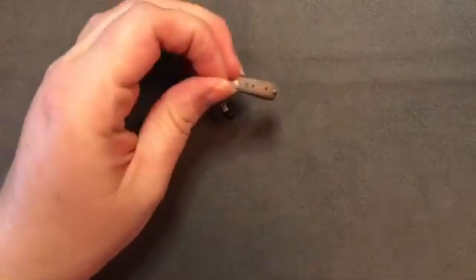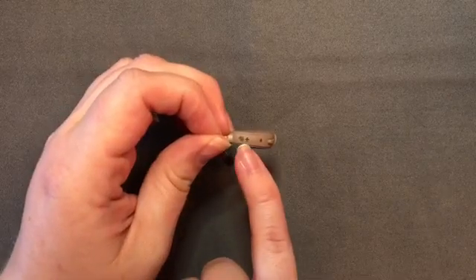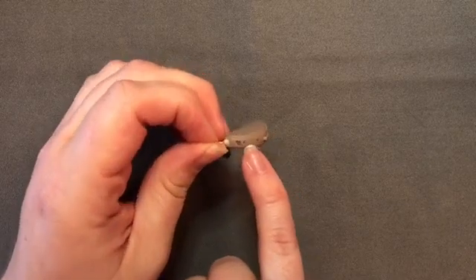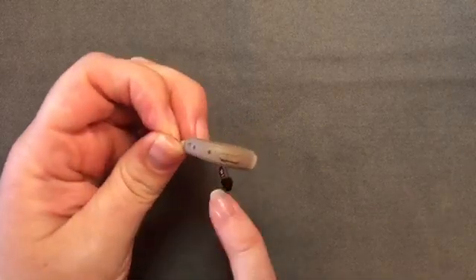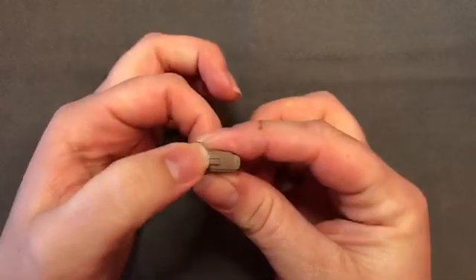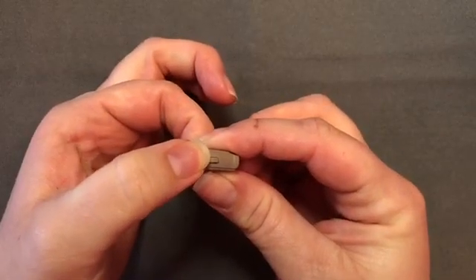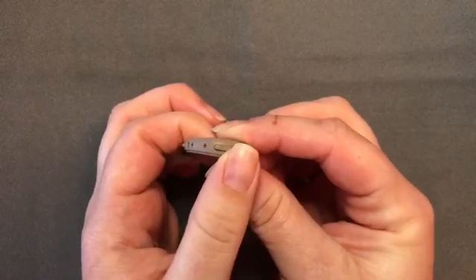If we look at the back part — the spine of the piece that fits behind the ear — that's where the microphone openings are located. On this particular device you can see there are two openings, and below those there is a toggle switch for either volume control or program change, depending on how your device is programmed by your audiologist.